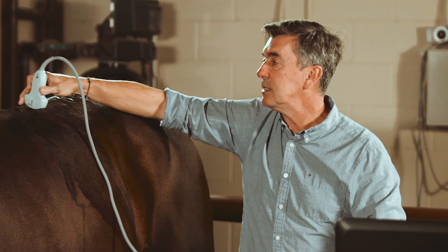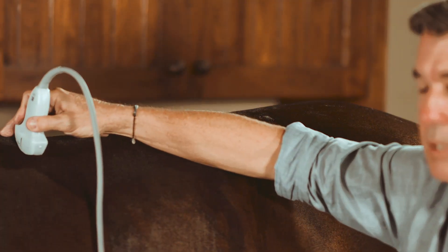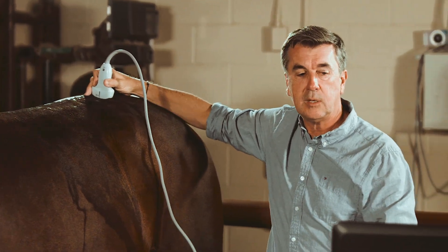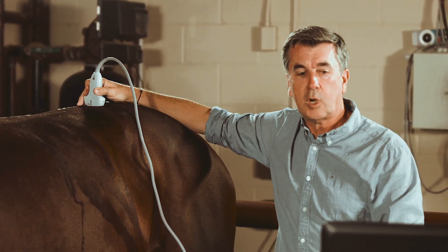This is what you can see with these transverse views, all the way starting from the thoracic area — including the costovertebral joints — to the thoracolumbar and lumbar area, where you can see with more ease the articular processes and the muscle structures.